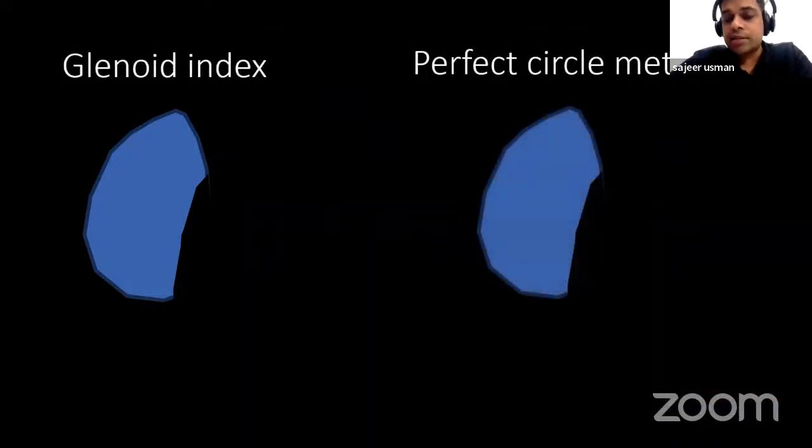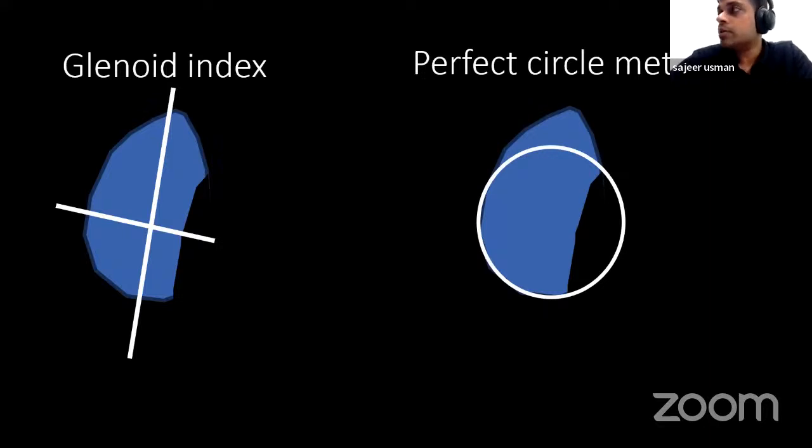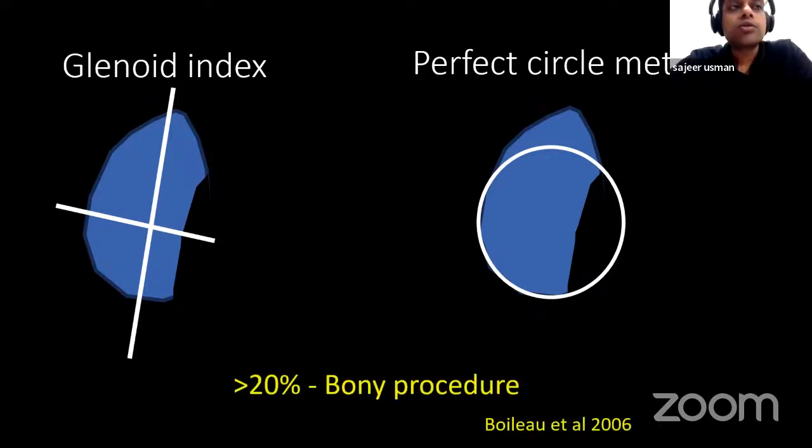And how do we assess this? If we get an MRI or a CT, we can do the different methods of testing and checking the glenoid bone loss. But the easiest method for me is just drawing a circle on the face of the glenoid. In an en-face view, classically on a CT, you can understand how much bone loss there is by analyzing the area or the quadrant where the lack of bone is seen and taking a percentage of this. So typically, if the radiologist reports a 20% bone loss, you know that this is for Latarjet. This has already been covered by Mihir.